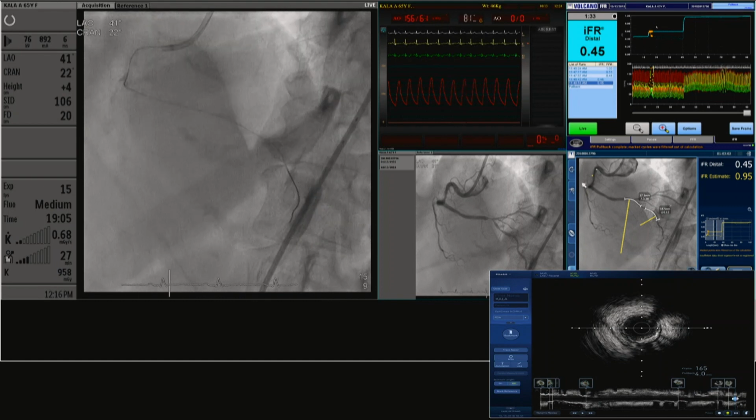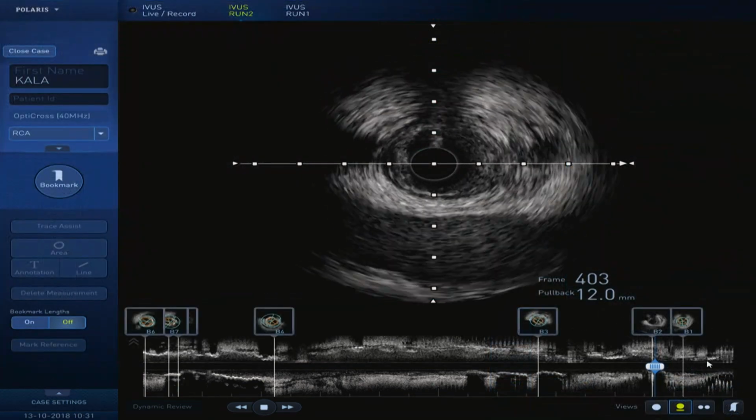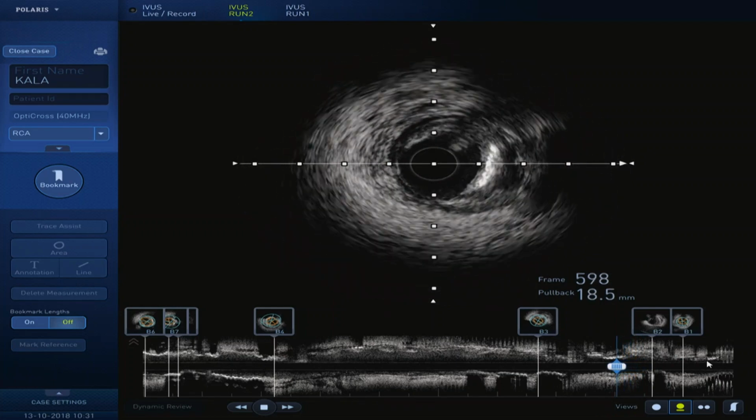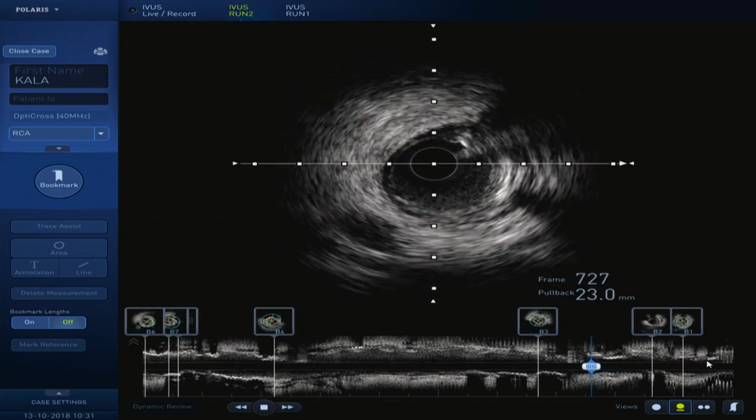So now we'll show you the IVUS. We have a pullback IVUS after dilatation with a 2 millimeter balloon, and you can see from the distal side. You can go ahead and read that for me, please. Yeah, sure. So we're in the distal vessel here. It's probably a 3 millimeter vessel. Probably wouldn't get more than a 2.25 in there. Gets very tight, just proximal to the bifurcation.